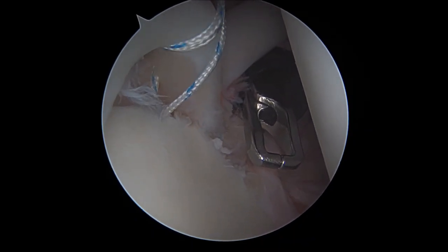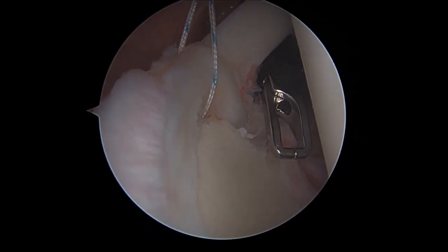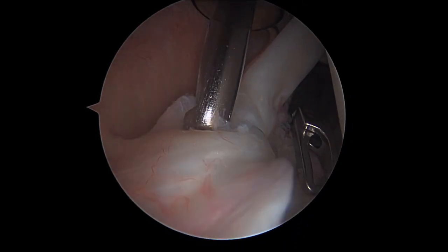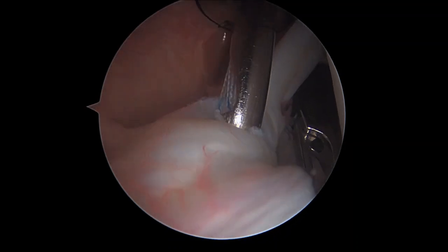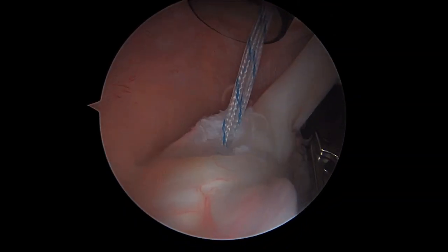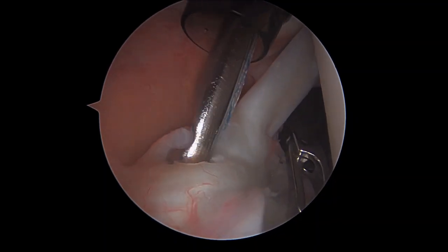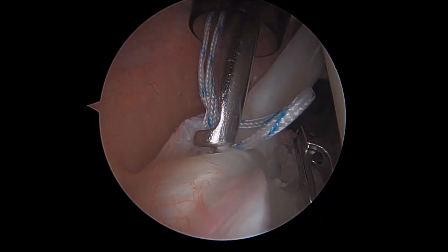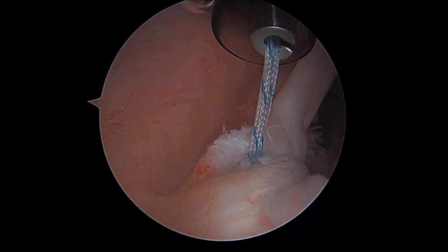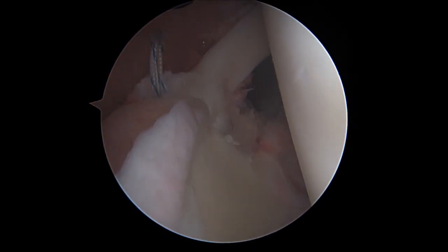Once we've passed it, we finally perform our knots. In this case we can see clearly: I will make a five-knot structure with the first two knots being the working ones, then a third security knot. We can add a fourth or fifth knot to be sure of avoiding a loosening of the knots during the post-operative period, and finally introduce our cutter to complete our knot by cutting both ends of the wires.